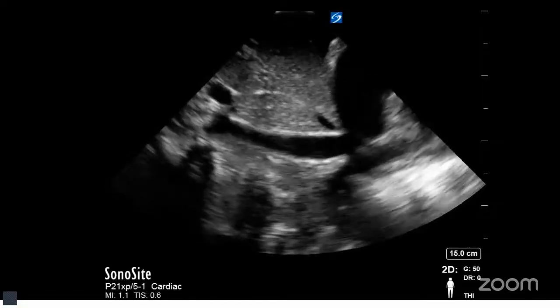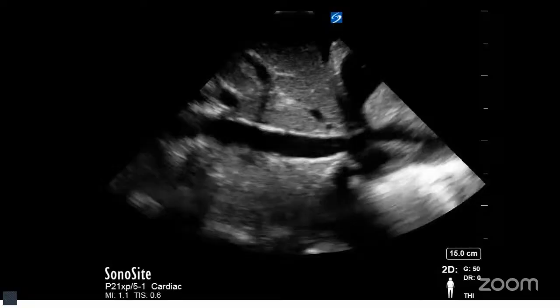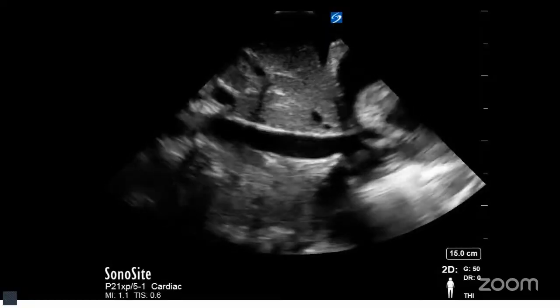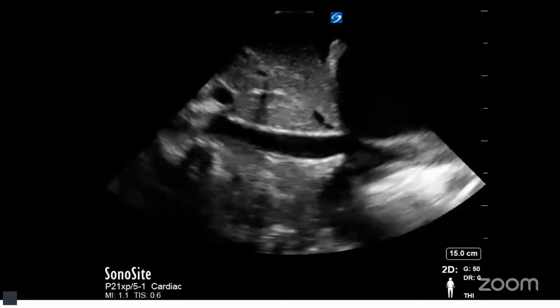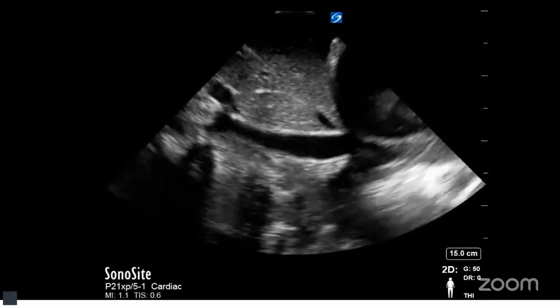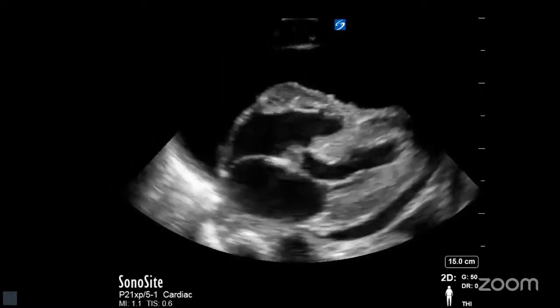So here's an example of a video like this I tend to use for teaching. You can see the IVC in the longitudinal view. You can see it draining towards the right atrium. You can see liver on both sides, and you can see a hepatic vein starting to go into this. And you might look at this and say, oh, this IVC is about 2 centimeters and is not collapsing at all. But you also, if you have a keen eye, can see around the heart an anechoic space. And when I rotate my transducer, I'll see that that brings me again to a large pericardial effusion.